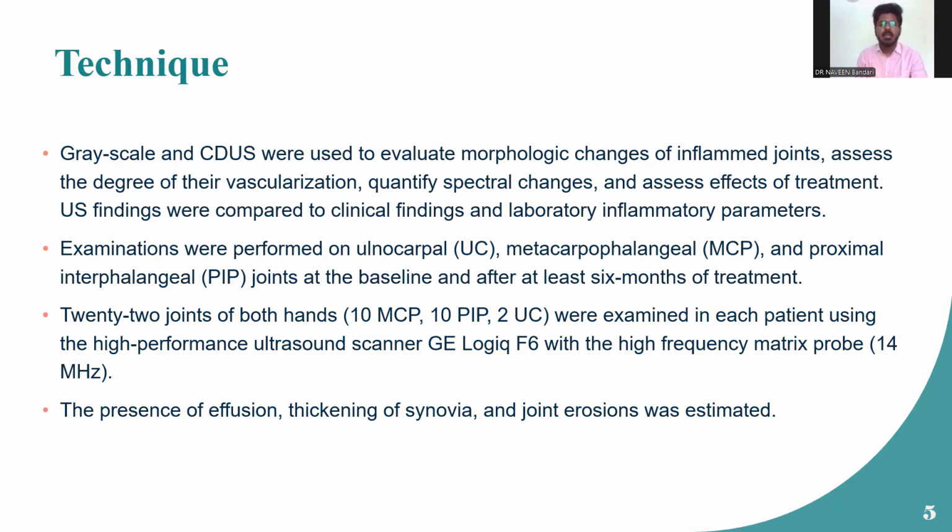Technique: grayscale and color Doppler ultrasound were used to evaluate morphologic changes of the inflamed joints, assess the degree of their vascularization, quantify the spectral changes, and assess the effects of treatment, and to compare these ultrasound findings with the clinical findings and laboratory inflammatory parameters.